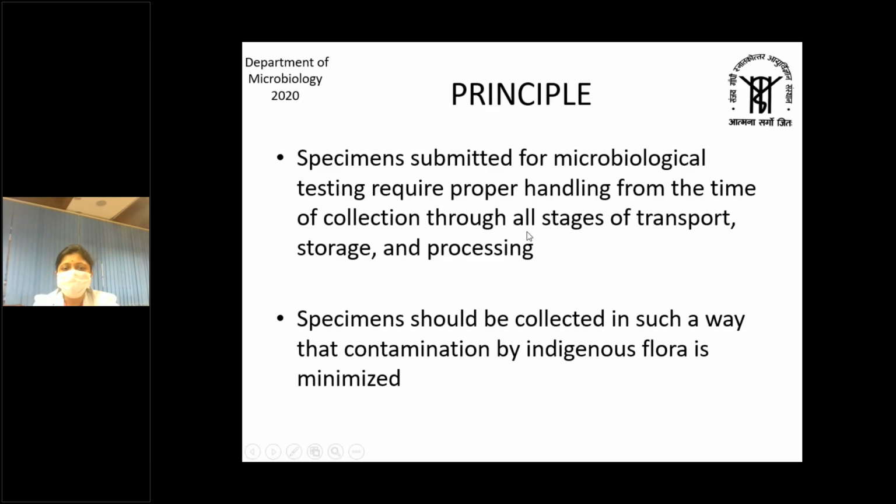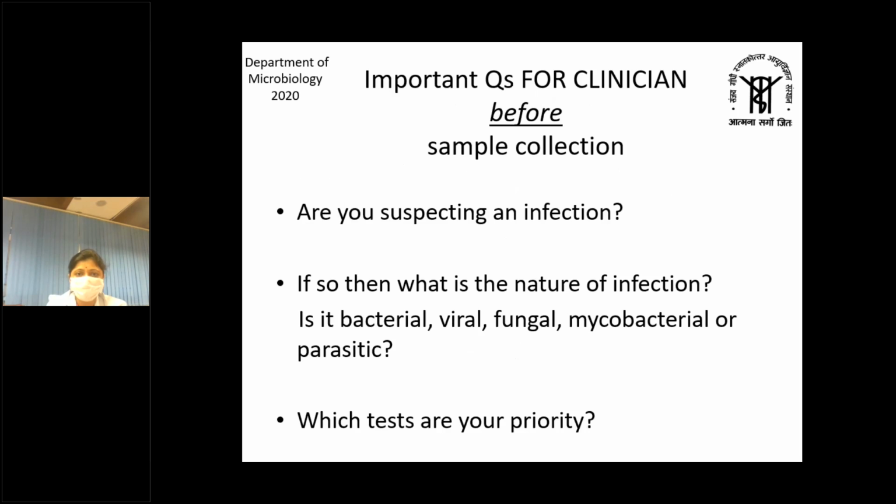So specimens submitted for microbiological testing require proper handling from the time of collection through all stages of transport, storage and processing, and they should be collected in such a way that contamination by indigenous flora is minimized. So the basic principle for collection of a sample for a microbiology culture laboratory is that there should be least contamination and strict asepsis.